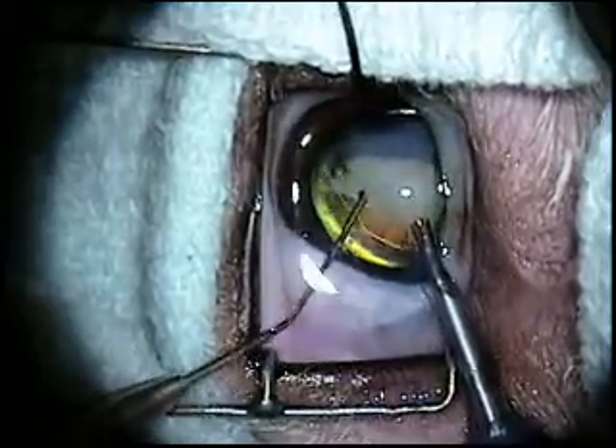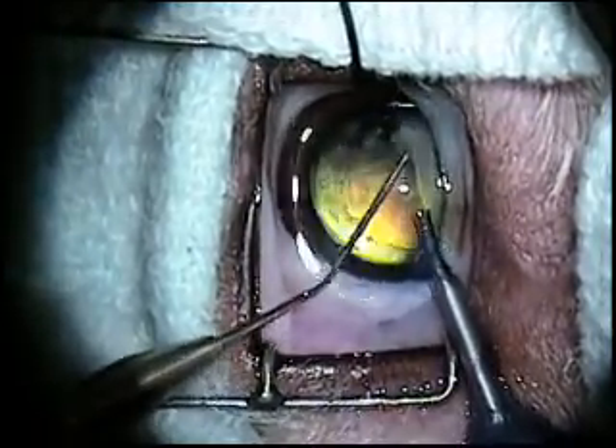After the bulk of the lens has been removed, an empty capsule or bag is created.